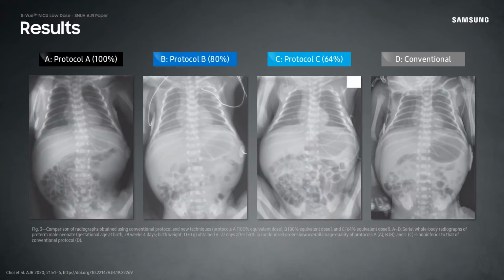Figure 3 shows the same patient imaged with the conventional protocol as well as the 3 SView protocols. The patient had a gestational age of 28 weeks and 4 days, a birth weight of 1,170 grams or 2.58 pounds. The images were obtained 6 to 27 days after birth, and images were taken in randomized order.